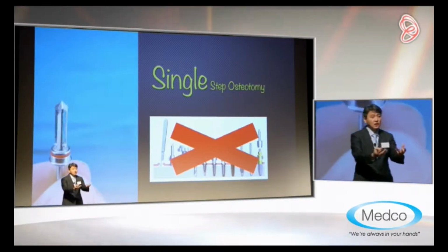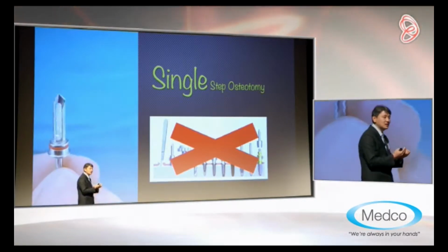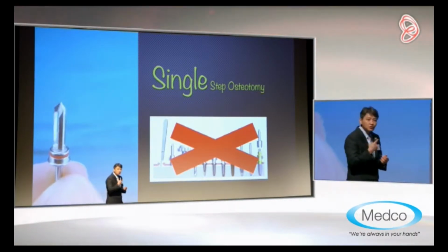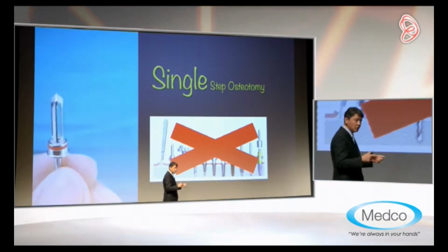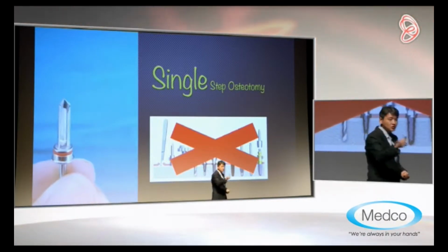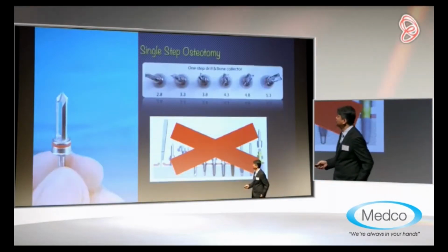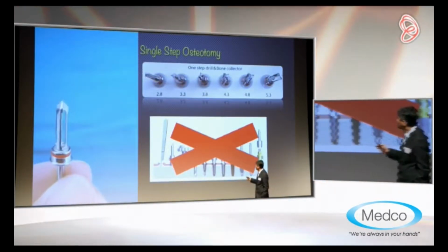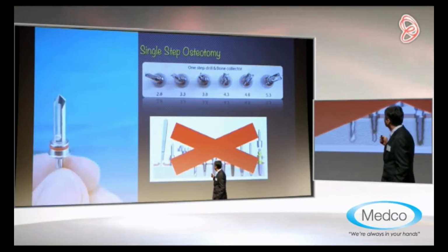Therefore, we are able to collect the bone inside this hollow space, and also we reduce the temperature during the osteotomy. Instead of using irrigation, we put these burrs in the refrigerator. And then we use one shot, and we can collect lots of bone for our procedure. If you are using 4.0 implant, I recommend 3.3 for the mandibular.